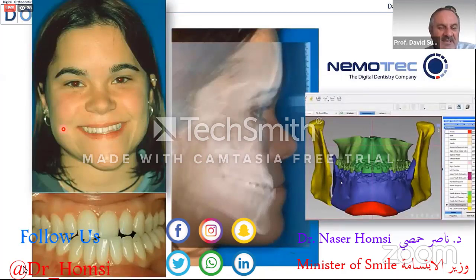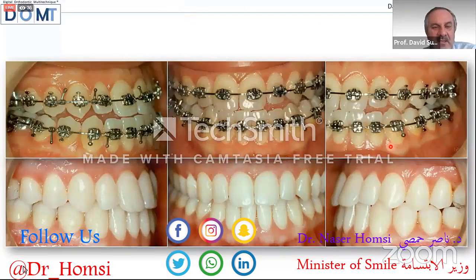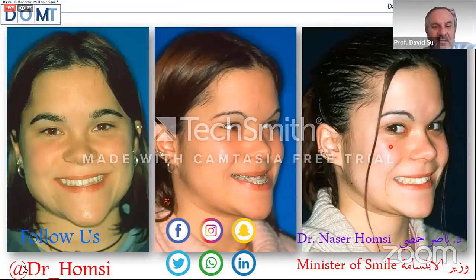Another patient with a class 3. Is it possible to treat this patient with extraction of the lower premolars? Maybe we decide with the Nemotec to analyze this, the end of the occlusion of the patient, and the most important is the face of the patient. For this reason, class 3 is the same if you are in the Roth technique, the same in the Damon technique, the same in the MBT technique, the same in a classical Tweed technique, the same in the bioprogressive technique.